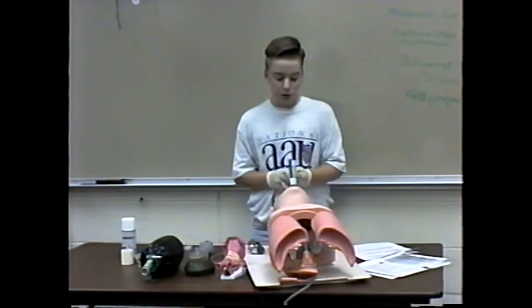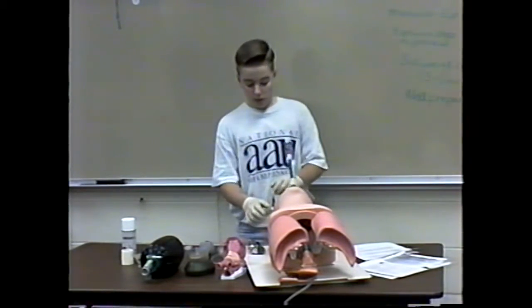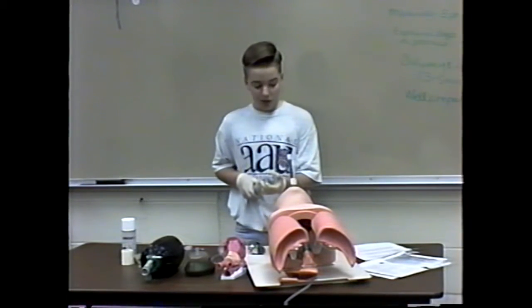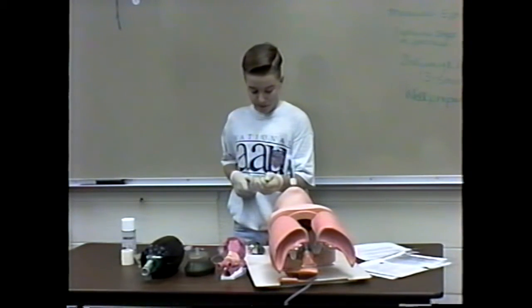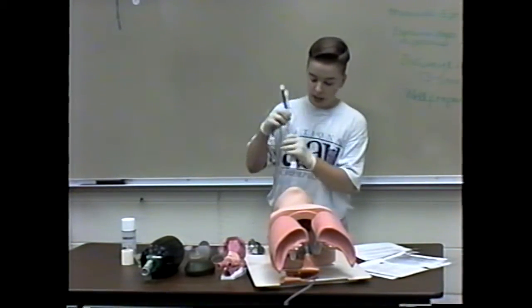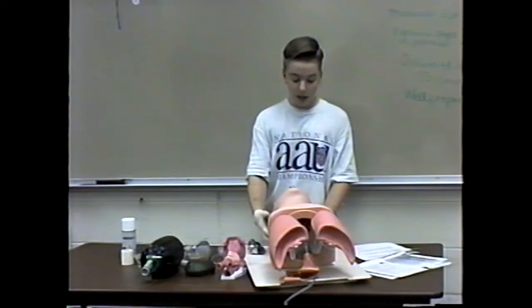Also, with intubation, you can not only give air to the patient, but you can put medications down the tube instead of using an IV, like sticking it in their arm. It takes longer that way. It takes about 5 to 10 minutes for the medications to start moving all over the body, but for an IV, it only takes about 1 to 2 minutes.